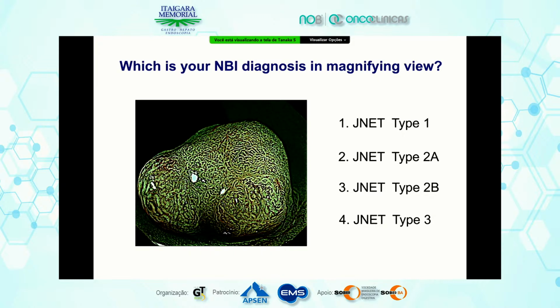Please show me the result. JNET type 2A and JNET type 2B, half and half.